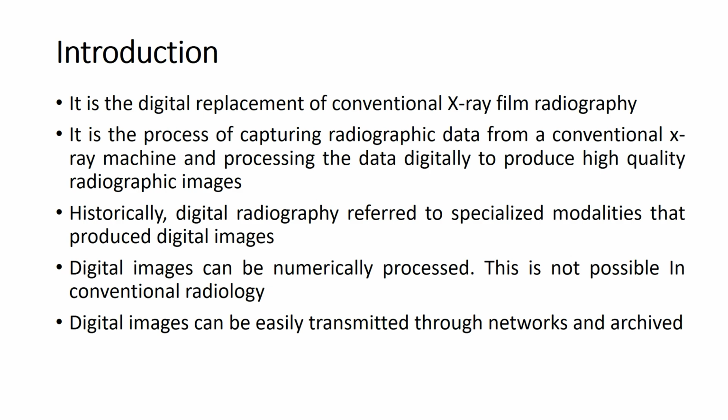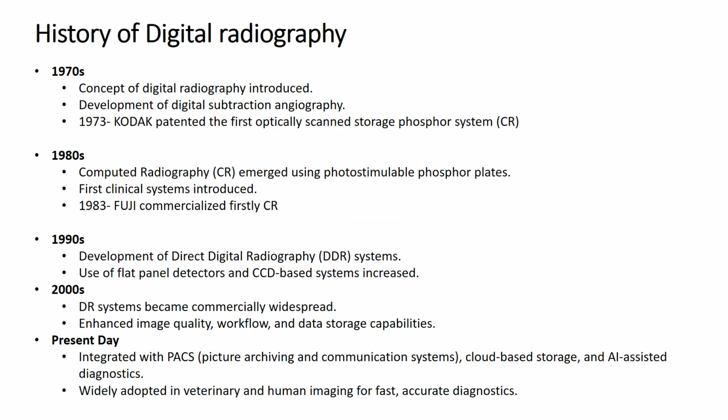This is not possible in conventional radiology. So the digital images can be easily transmitted through the network and can be archived in the form of data.